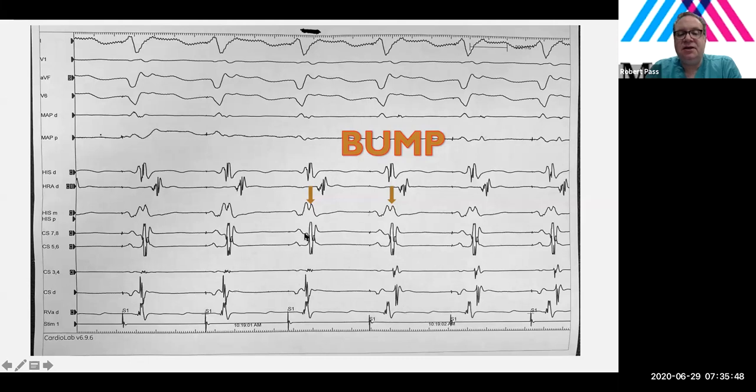So clearly we have inadvertently injured the accessory pathway by the catheter just gently touching it, causing conduction block in the accessory pathway. Now, in the old days, before we used 3D mapping, we would basically just say on fluoroscopy, well, it looked like it happened about here or there, and we would burn at that location, and then burn a little to the left and a little to the right, and cross our fingers and hope that we had actually ablated the location where the pathway went away.